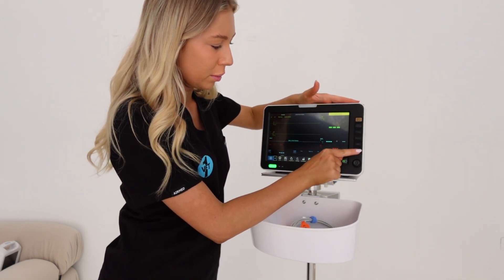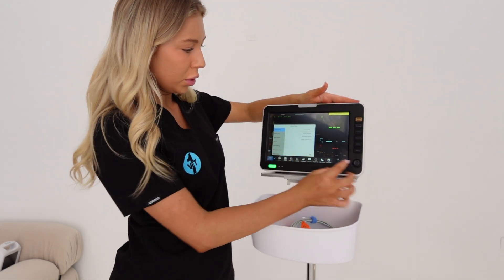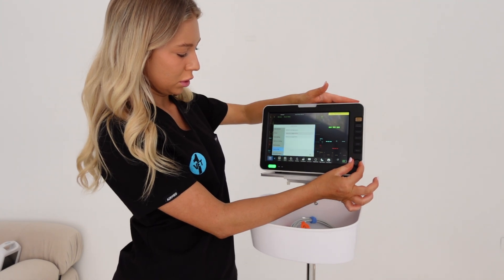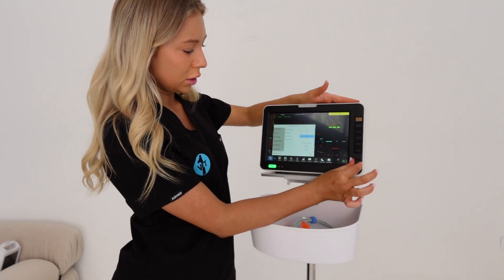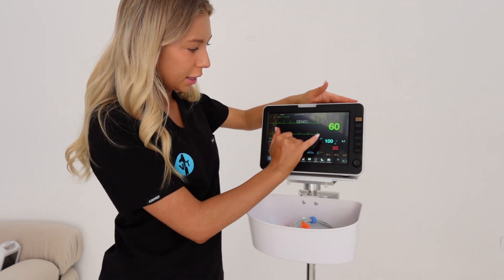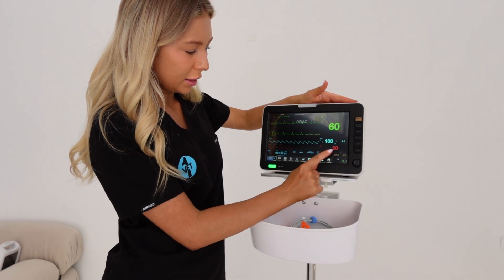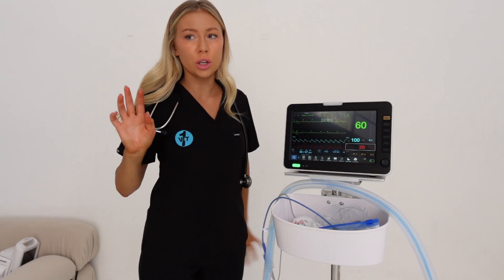There's a menu button down here. You just press the little dial in to select and scroll down. It'll display a nice trace, blood pressure, heart rate, SpO2, respiratory rate, and temperature. That's the VitaView 10.